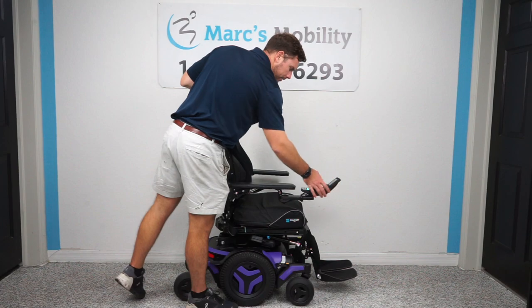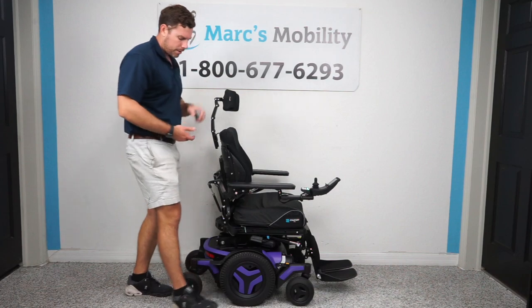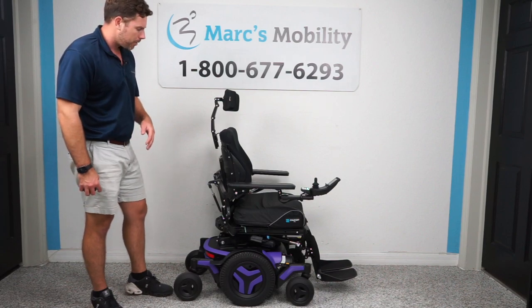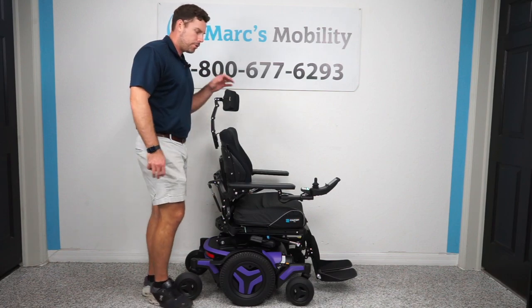This particular unit has 21 miles of total drive distance. This is their purple color. We can change it for about $200 to almost any of the colors that Permobil offers, so if you don't like the color, just let us know. We can fit this to you.